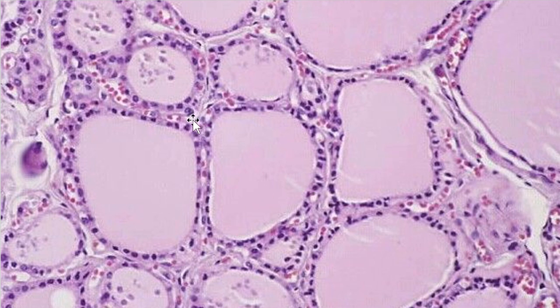So it's very important that you have an adequate amount of iodine in your diet, because that's what we use it for. So in this colloid, that's iodine in here. So we have our follicle, we have our colloid, and then around the follicle itself is where we're going to find those follicular cells. Think follicular cells, follicles. So they're just going to be the ones that's right around the edge.